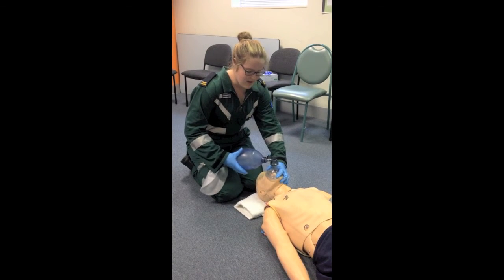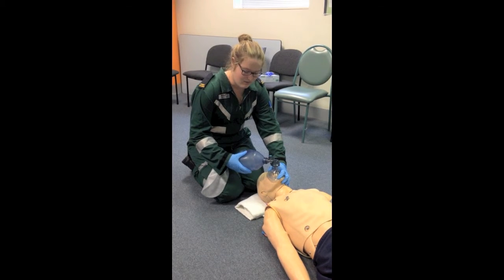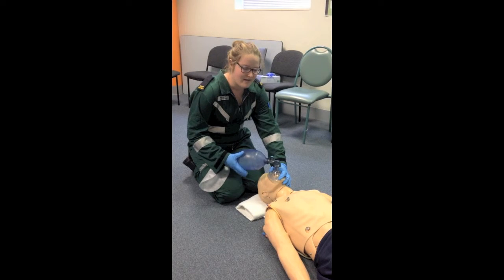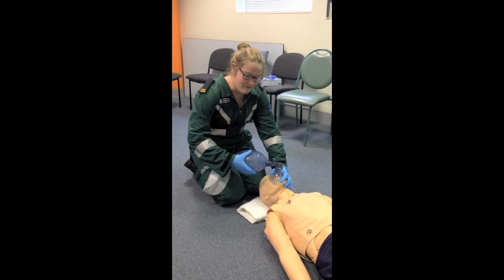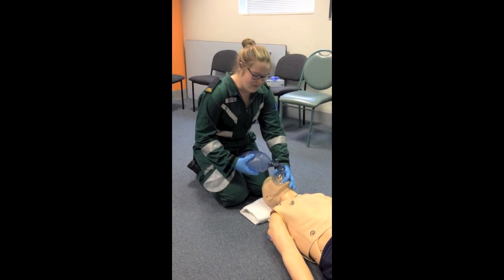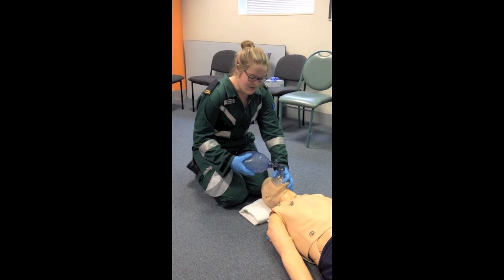And to determine their tidal volume, which is how much air you'll put into their lungs, you estimate their weight or ask someone their weight, and you times it by 10. So I'm assuming this patient is about 70 kilos, so 70 times 10 is 700 mils. So that's about 1/3 of this bag, which is 2 litres. And I will ventilate them 12 times a minute, so that's one ventilation every 5 seconds.